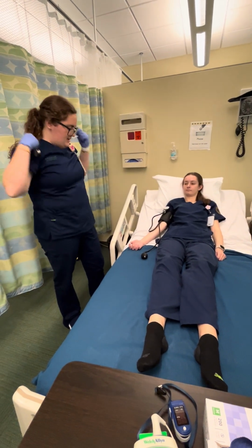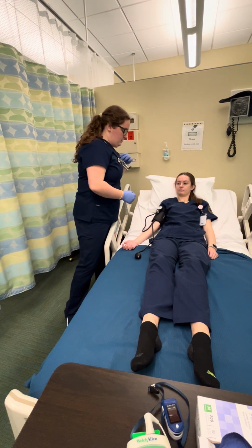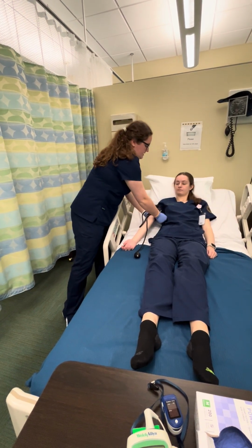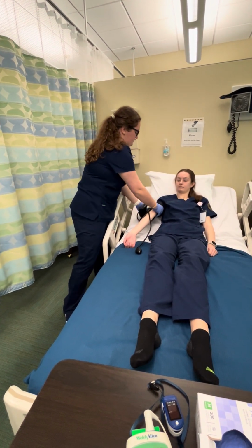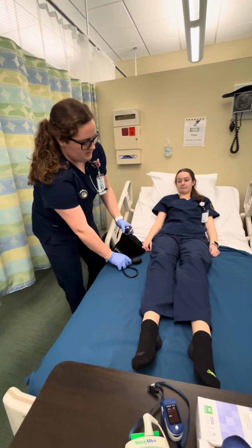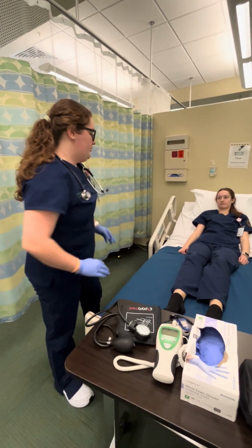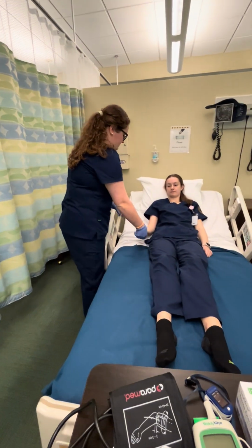Okay, her blood pressure was 114/76. So that is within normal range for blood pressure. And then I'm going to get your pulse rate and respirations.